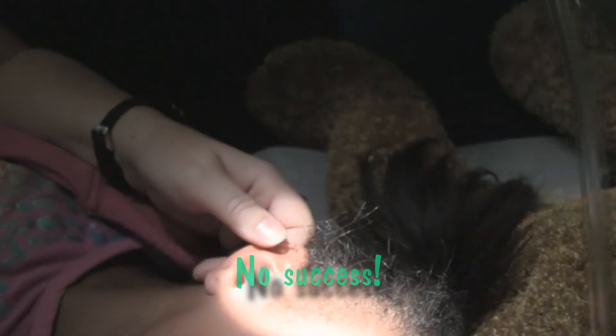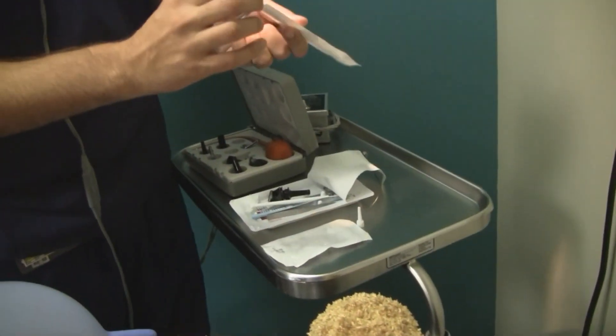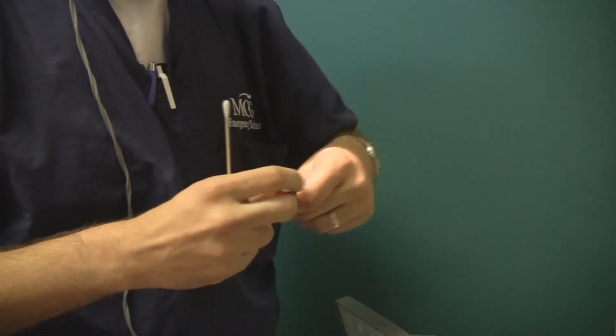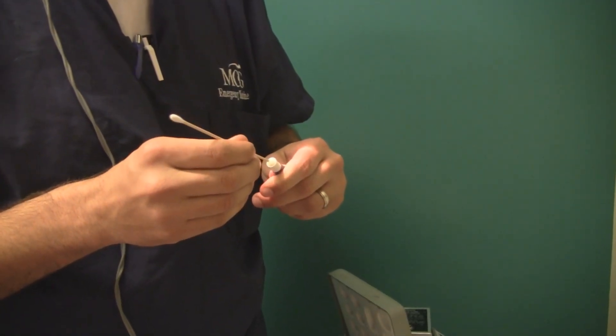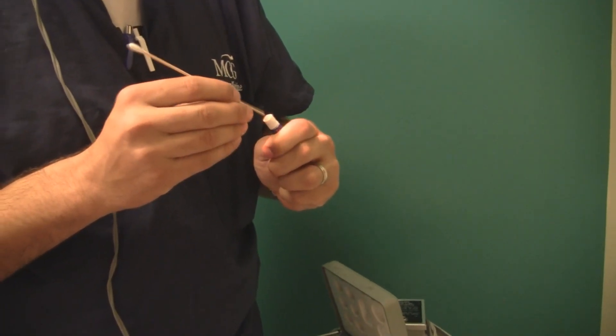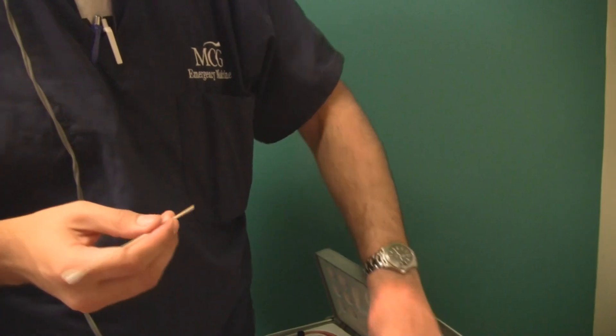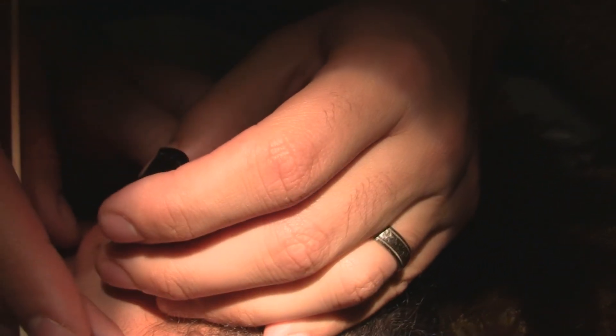Let's try Dermabond next! So that was a good attempt. We're going to go ahead and try a little Dermabond on the tip of a Q-tip. The trick here will be to get just enough but not too much. Your job will be to stay real still — we just have to hold really still. This shouldn't hurt.